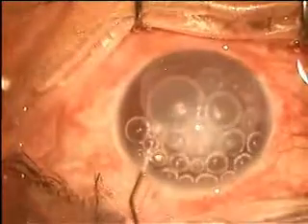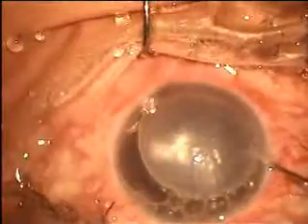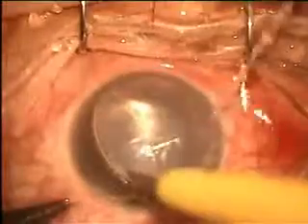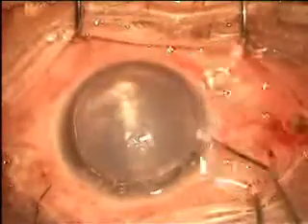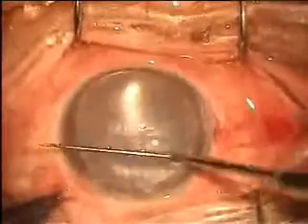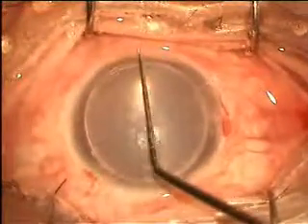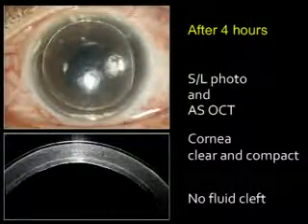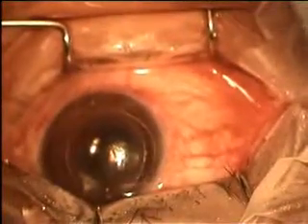Air was injected into anterior chamber. External manipulation, massaging and centering of the donor button done. More air bubble to make the eyeball tight. Immediate anterior segment OCT confirmed nice reattachment of donor button. After 4 hours, cornea appeared much clearer. Part of the air was replaced by balanced salt solution.